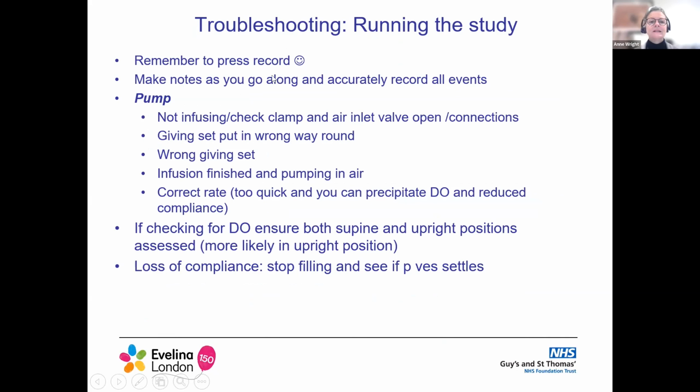Running the study, remember to press record. Some machines actually need you to start the study and record. If you don't, you lose the whole thing. Make notes as you go along, because again, computers can crash, electricity can stop, plugs can be pulled out of the wall, and then you lose all your information.